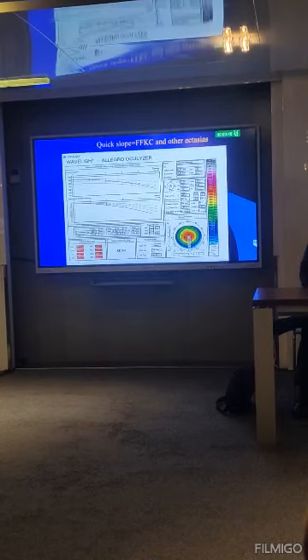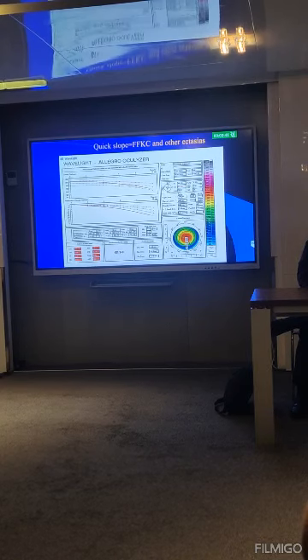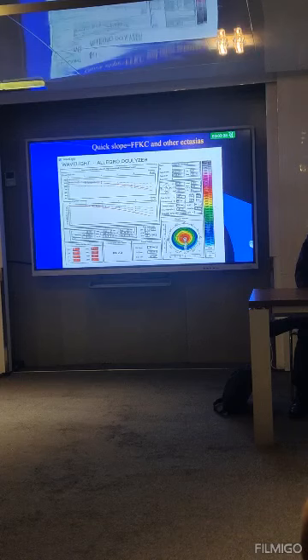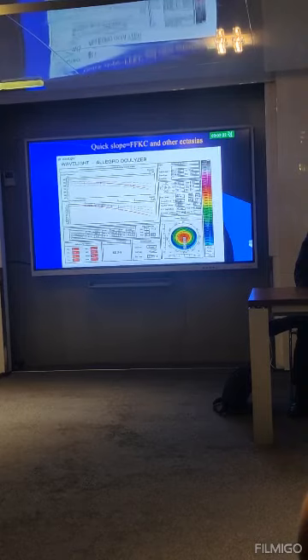A normal curve should follow these lines regularly until at least the 6 mm ring, and after that it can bend, no problem. But if the curve starts bending before 6 mm, we can call this a quick slope, which is seen in forme fruste keratoconus and other ectasias.